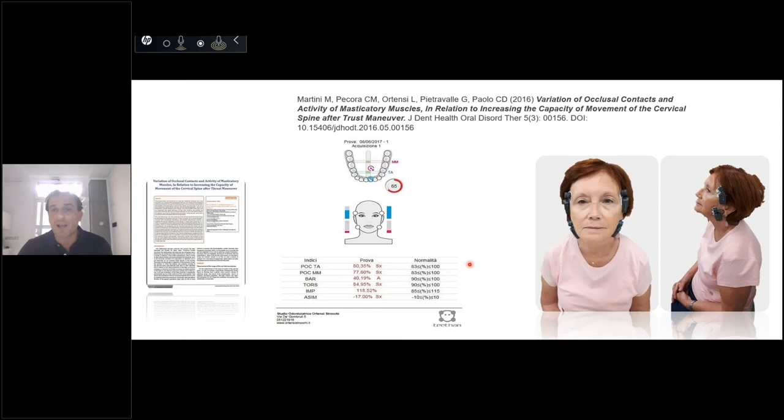And I did an exam with Teethan. And you know, here, the position of the mandible is not good, and you have an impact bigger than normal. I don't like it, but it's important because now you have a lower vertical dimension. And now I want to improve the vertical dimension. But this exam is fundamental in my daily practice, because now I know something more about the patient, and I can improve my therapy.